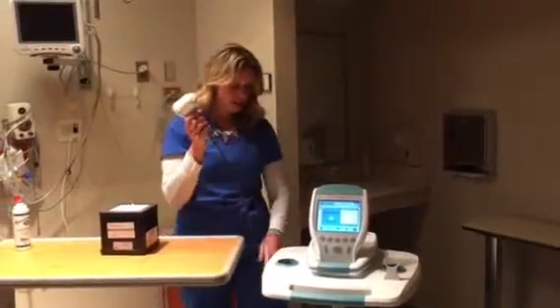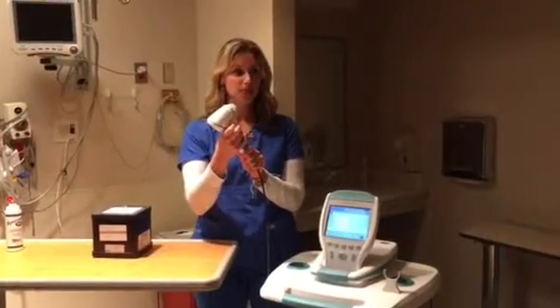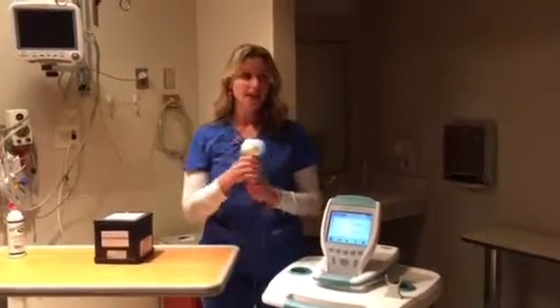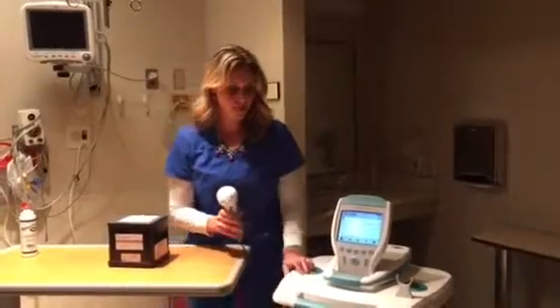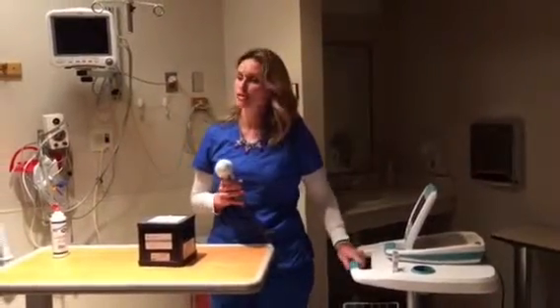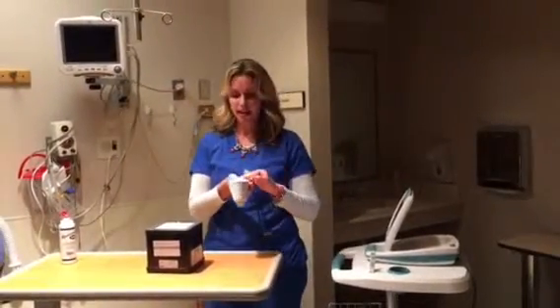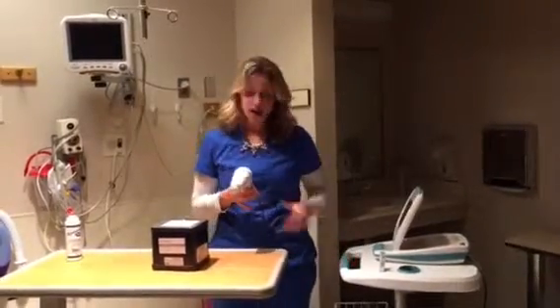Now your probe is different in this scanner versus your other probes. It's a trigger probe. It's just press and release to activate the picture. You're really taking a picture of the bladder. So you're never going to be moving the probe around, and it's only a 3-second scan. So once we're ready to scan, in your health stream video you saw that your scanner needs to be in your left hand, and the patient's head needs to be to the left and the feet are to the right. The reason for that is you want your scanner and your probe to mirror up with the arrows, and I'll show you that in a second.